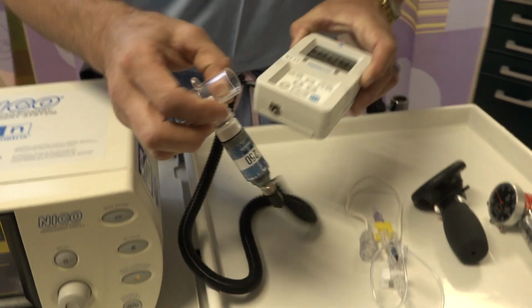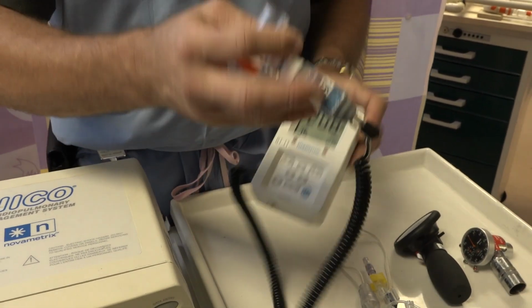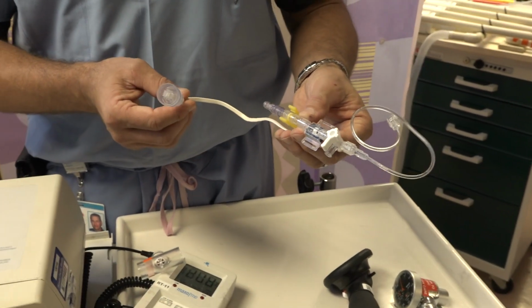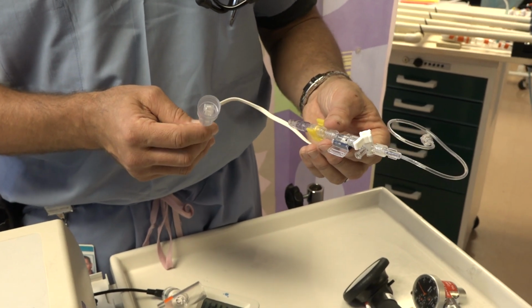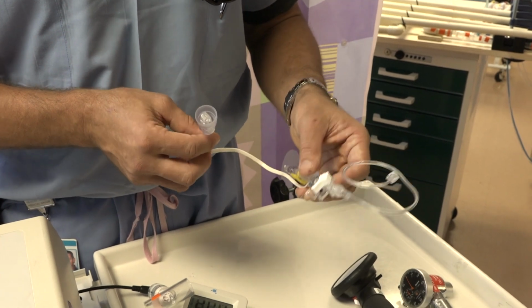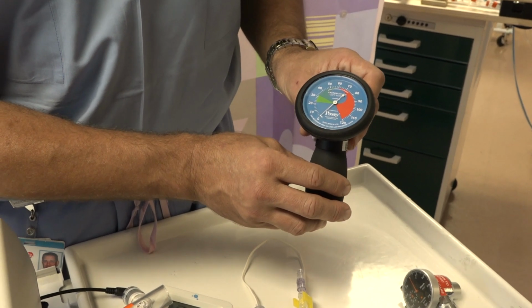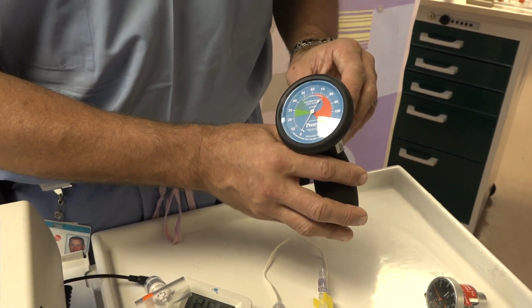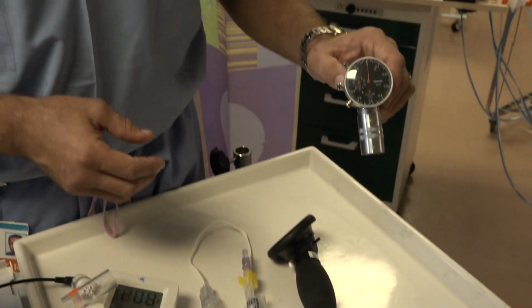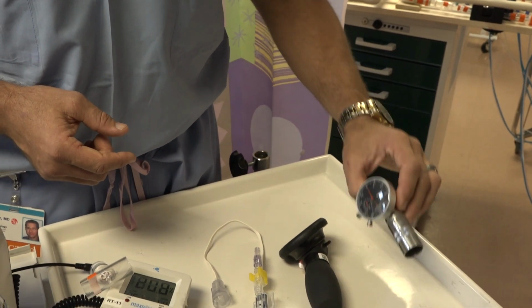Next, we get over here. This is an inline connector here which can read a patient's FiO2 for individualization of the patient's FiO2. Next, this is an arterial line transducer. This could be attached directly in line to give the patient's pressures in the airway. And I think we showed this before. This is a manometer that can be attached with large bore tubing directly to the patient's airway, and a respirometer right here, which can be used in line to measure a patient's tidal volume.